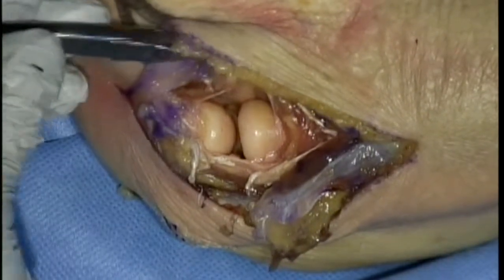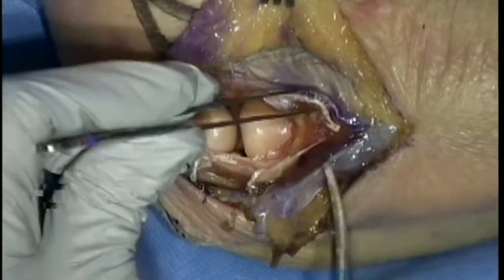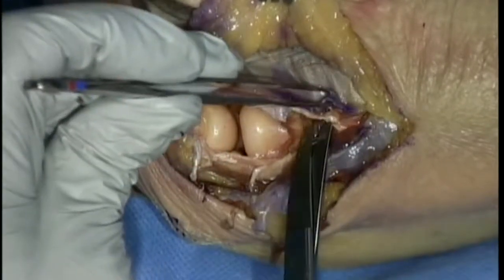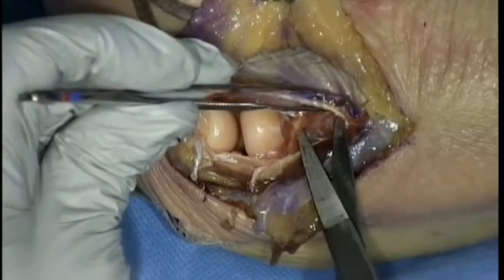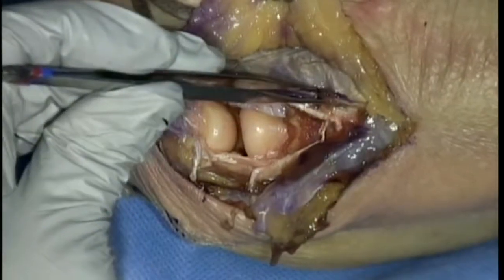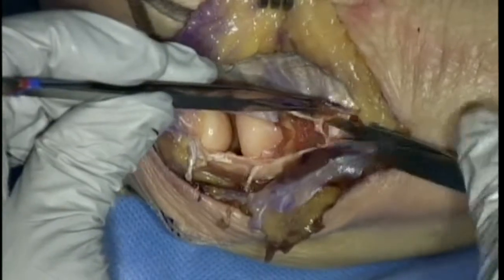No, I'll tell you what I do personally is I go back and I do use the Kaplan, and then I open up the fascia distally here, and I start very carefully dissecting the supinator muscle until I find the nerve branches, and then I just work around it. So just sort of like what I'm doing here, and then you can usually find the little nerve branches. They're not very big at this level, but you can find them.